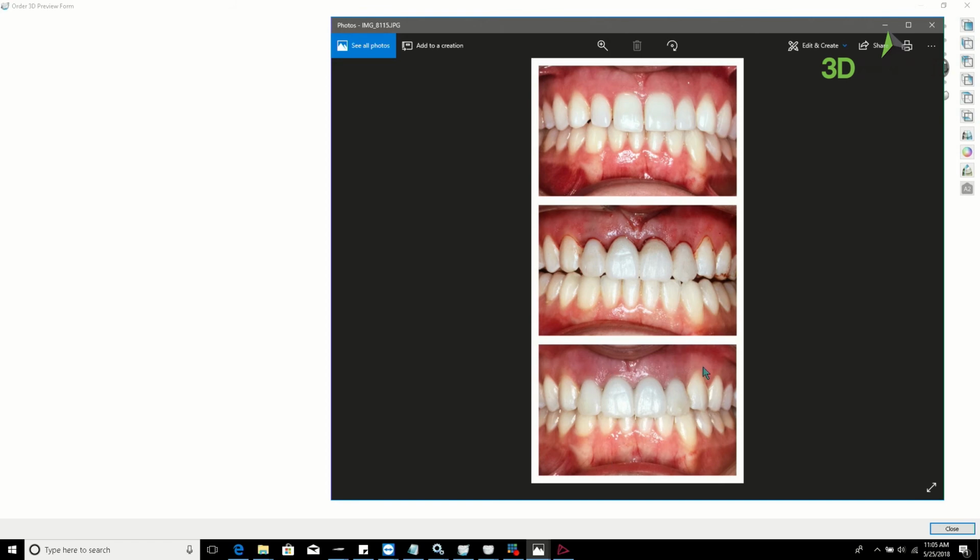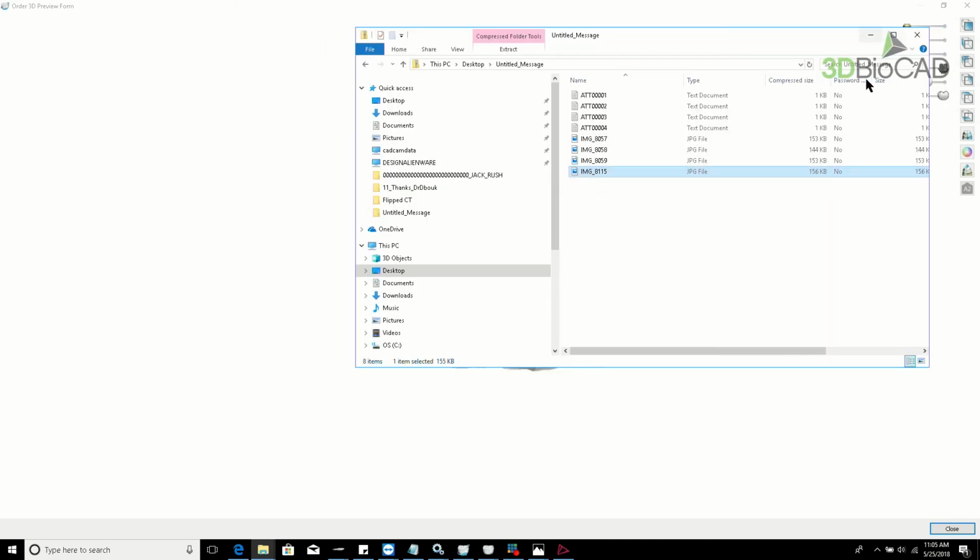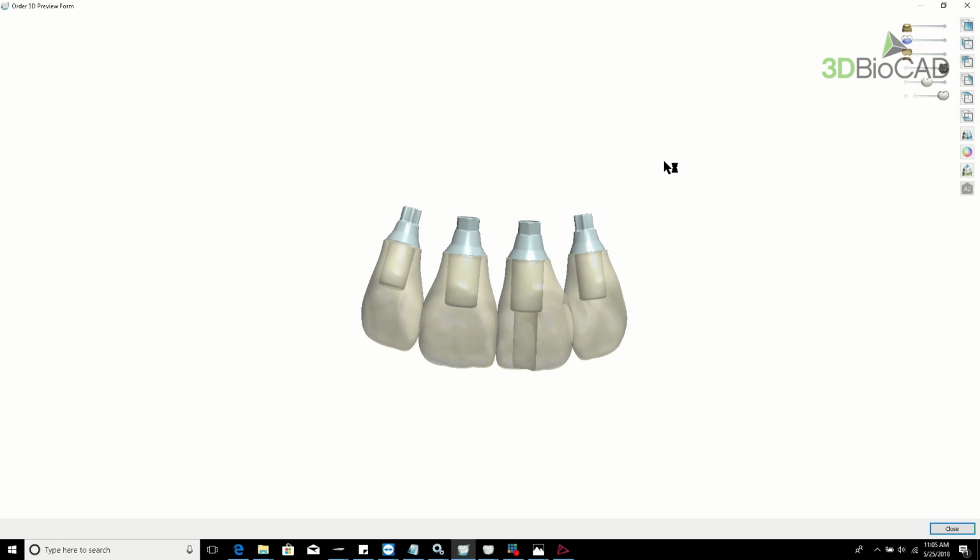Also the doctor used some, I forgot the name of that skill, but they take the patient's blood out and then do something and spread it there to make it better and heal faster. So before, right after, week after. So we can see that. So this way, maybe to you it's not really something new, but at least if we know how to use Implant Studio well and how to use the dental system well, we can just go this way, and it's good for everyone. That's what I'm thinking.